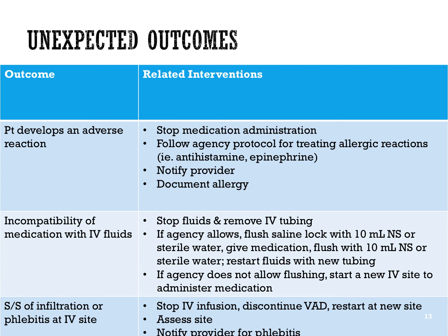What we do when either of these conditions present, we would stop the IV infusion, discontinue that IV, and restart the IV in a new site. We want to assess the signs and symptoms that the patient has, and again notify the provider if the patient has signs and symptoms of phlebitis.